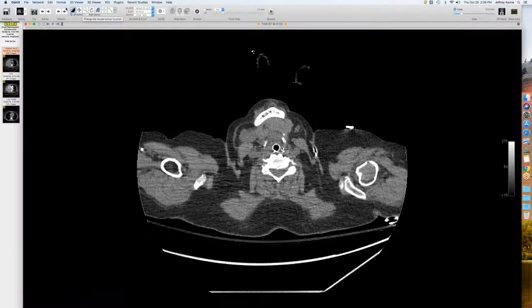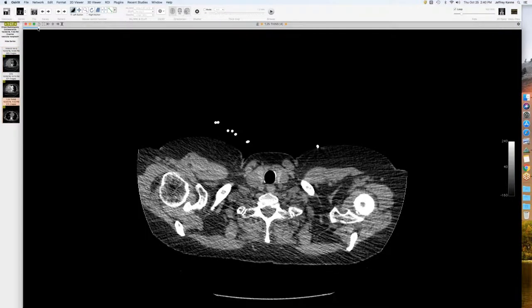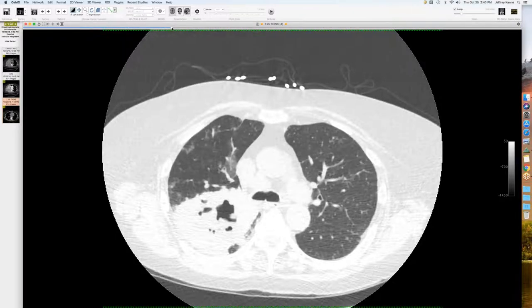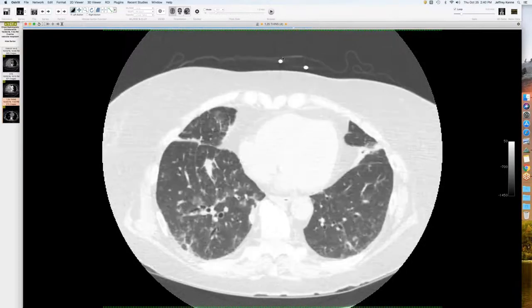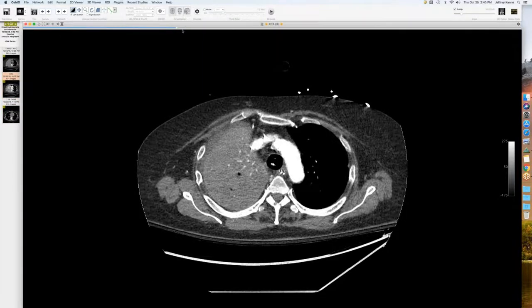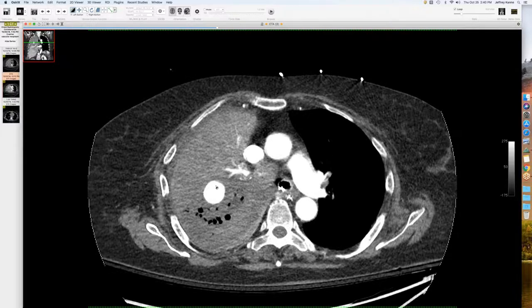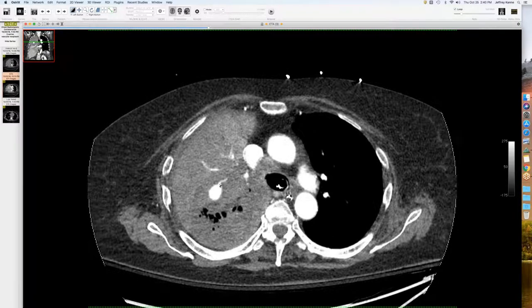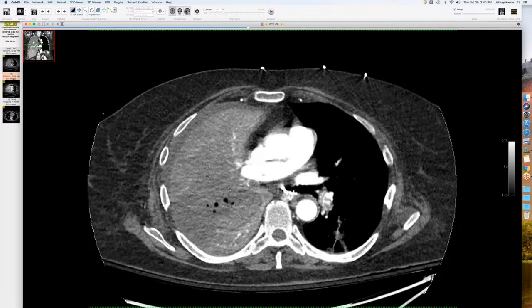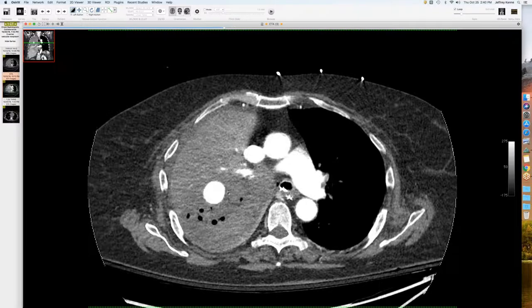Speaking of pseudoaneurysms, I have a good case. This is a patient with known metastatic renal cell carcinoma. You can see there's this cavitary, complex mass in the right lung with metastases elsewhere. This looks like an infected or necrotic lesion. Then about a few days later, the patient presented with pretty extensive hemoptysis. The whole right upper lobe is consolidated, and you've got this round enhancement blob coming off a pulmonary artery in the right upper lobe — plus a PE on top of that.